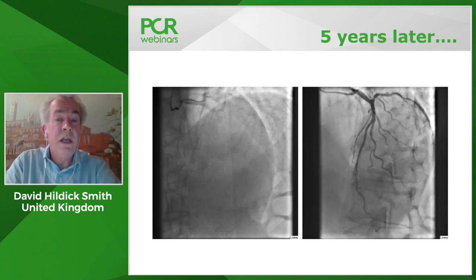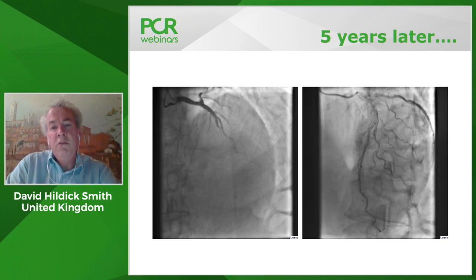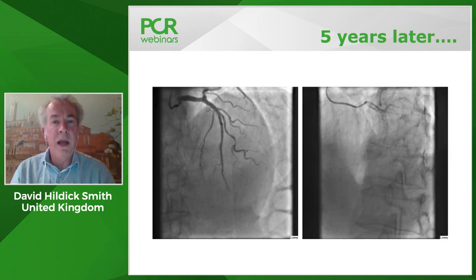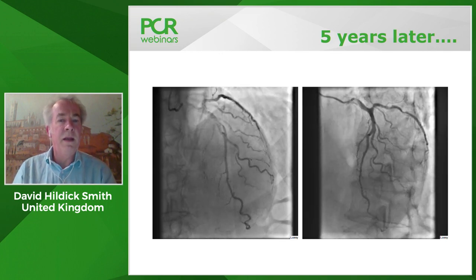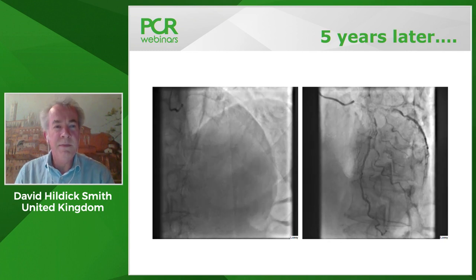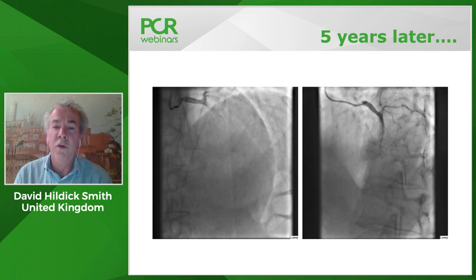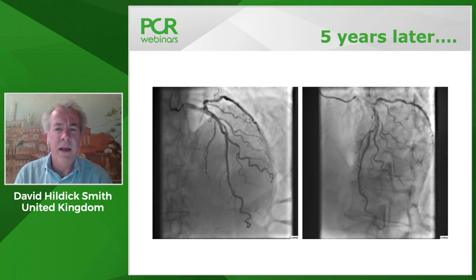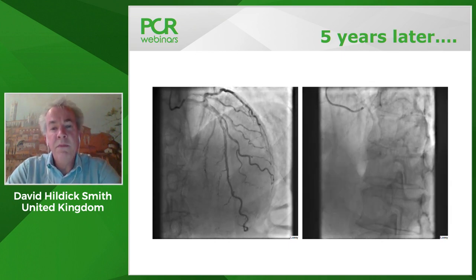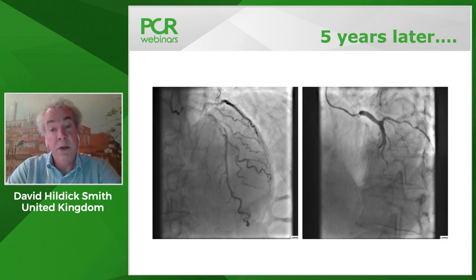So that's an interesting anecdote, but I think it's definitely worth viewing because often trainees don't get that linear perspective through time to see these kinds of results coming 5 years later. You know, you have to have a long career and be as grizzled as me before you see these things and recognize them for the amazing thing that they are with the human body. But so this was the result. It was interesting to see the outcomes, and often the outcomes with a simple strategy and a kiss into the side branch are remarkably good.